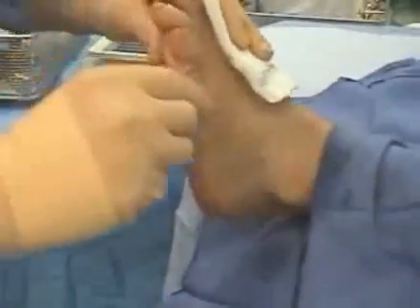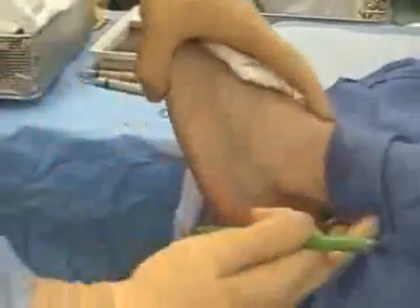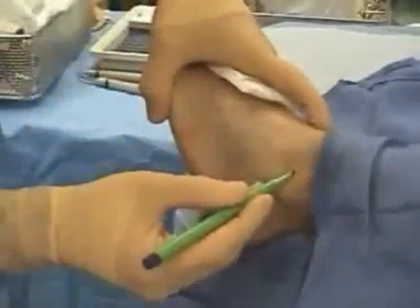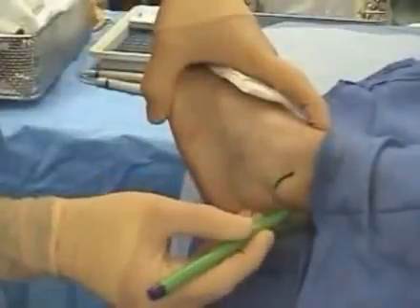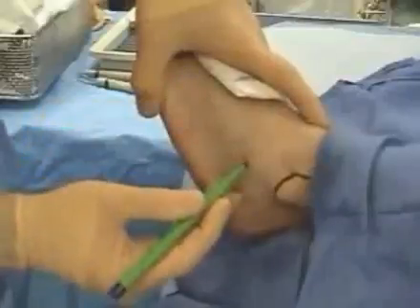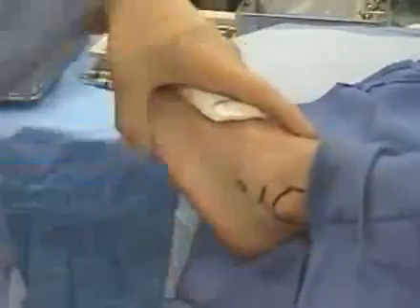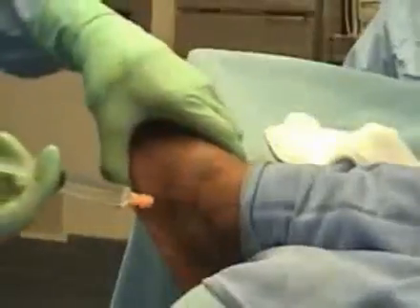So this is what I look at on the clinical table: just load the fourth and fifth met heads, and that shows the obliteration of the sinus tarsi. Here are our surgical landmarks. This is the fibular malleolus, and then we have the anterior calcaneal prominence, and our incision is going to be about an index finger distal to the fibular malleolus.